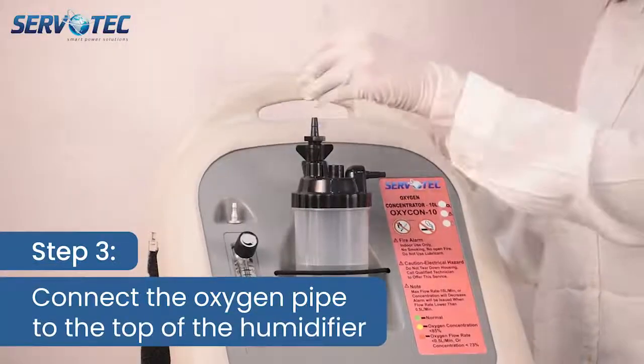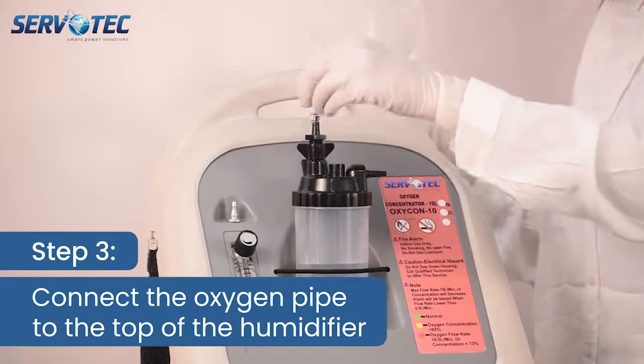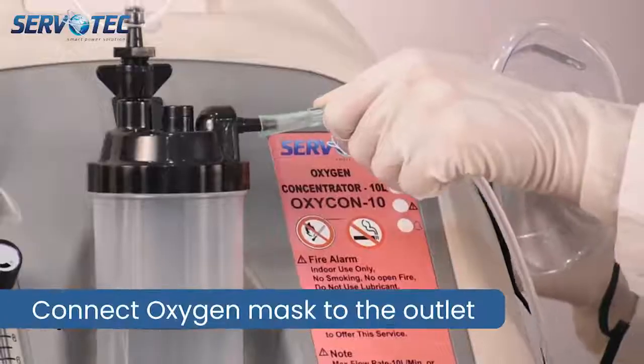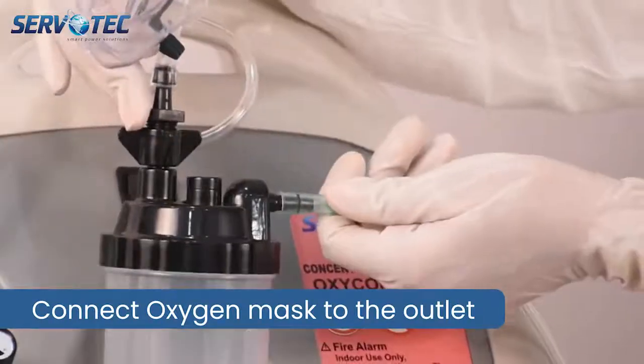Step 3. Connect humidifier bottle connecting pipe to the top of the humidifier bottle and cannula pipe. Oxygen mask to the outlet side of the humidifier bottle.